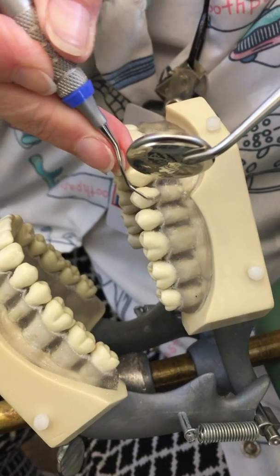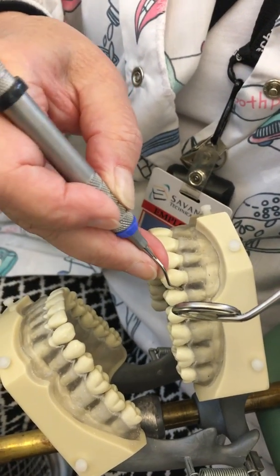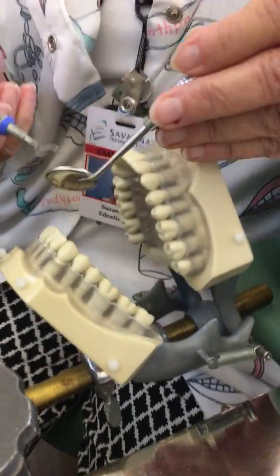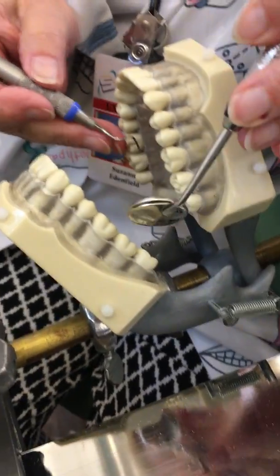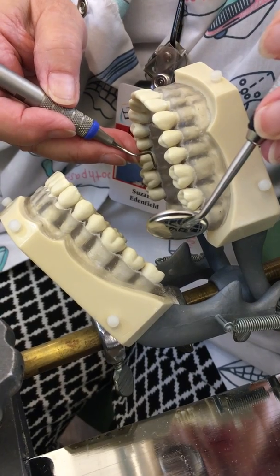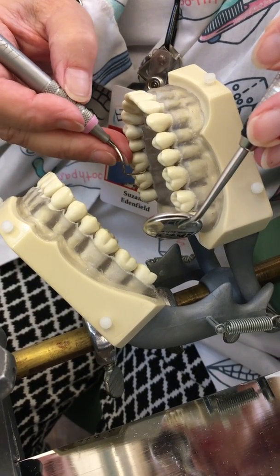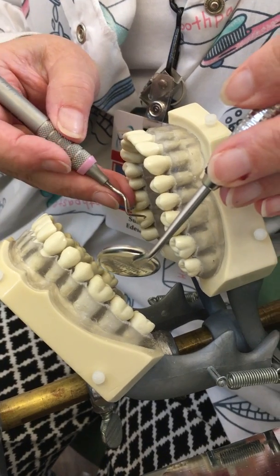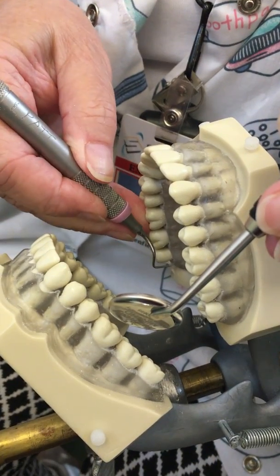Notice the fulcrum is piggybacking — or my second finger is piggybacking my fulcrum. Now we're going to move to our other distal instrument, which is the 17/18. We're going to use it only on the molars because it's best used for extremely deep pockets in the most posterior teeth. I'm going to place it on the distal to check for the correct end, piggyback my fulcrum with my second finger, place my fulcrum on tooth number three, roll my fulcrum over, and extend my instrument to the distal of the most posterior tooth. Go in closed and then open.